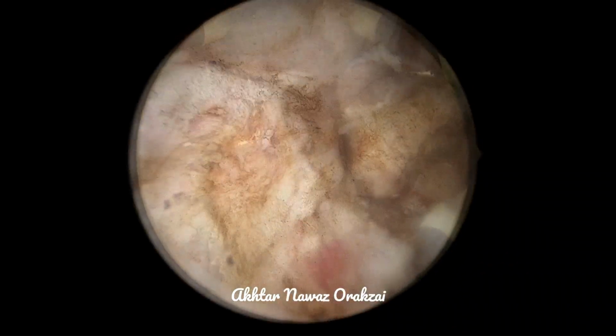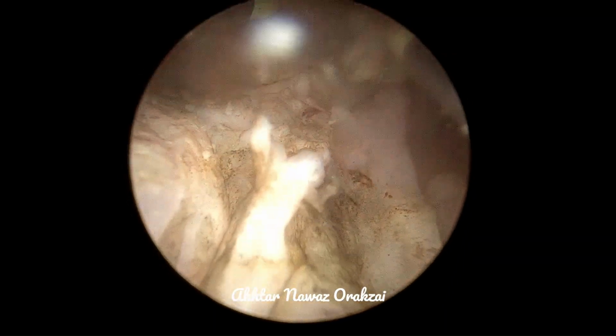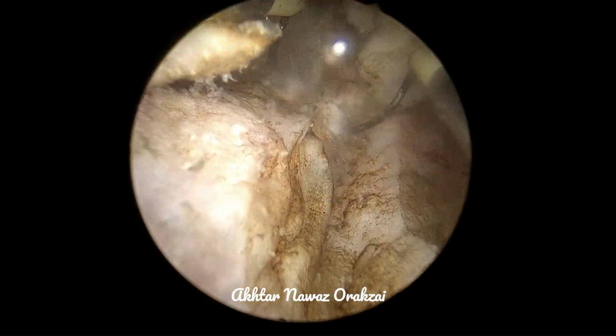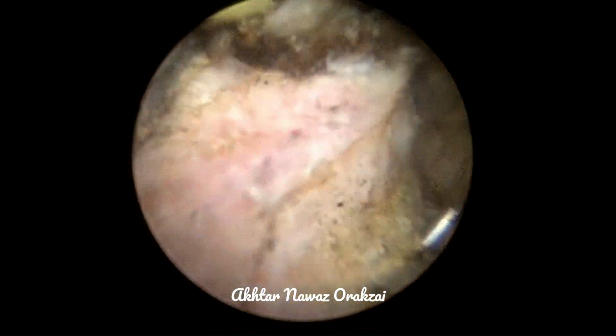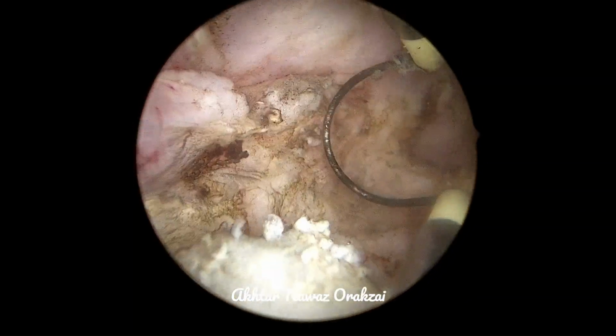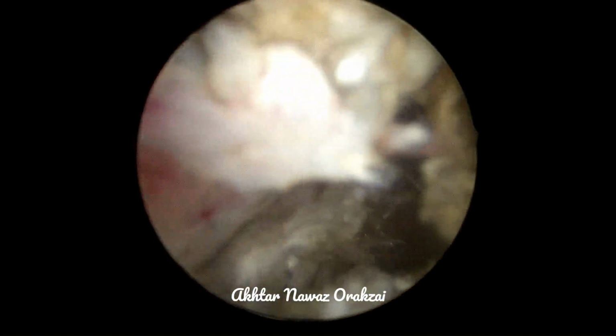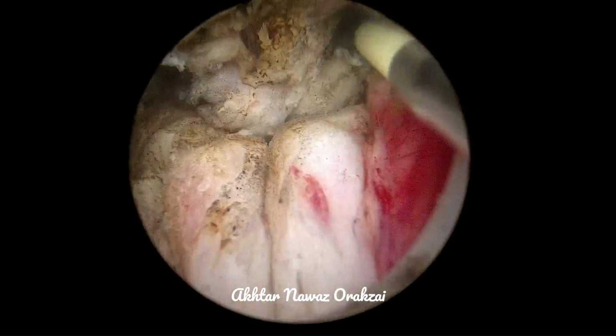So the capsular region, the prostatic urethral region, is quite overstretched, and beginners may think that they have completed the resection. However, completeness of resection must always be decided after the bladder is emptied quite a few times.